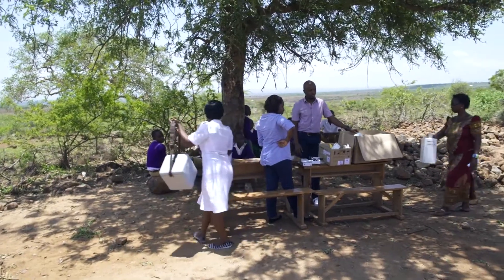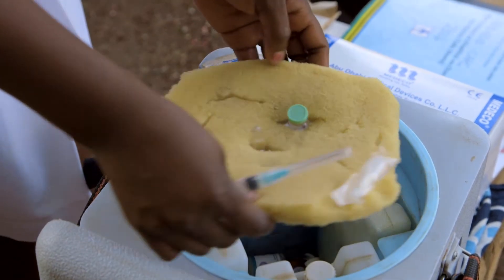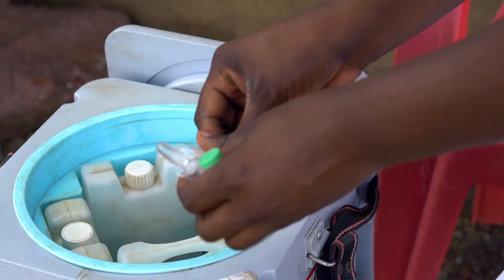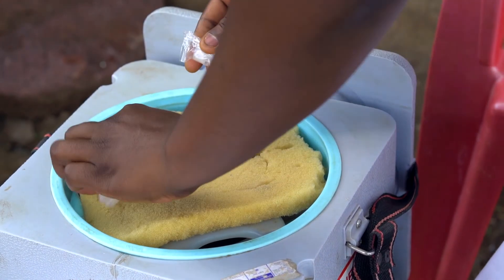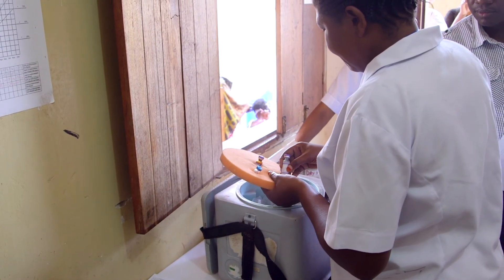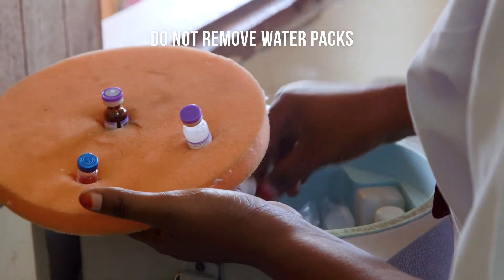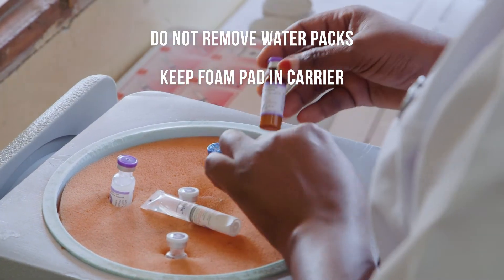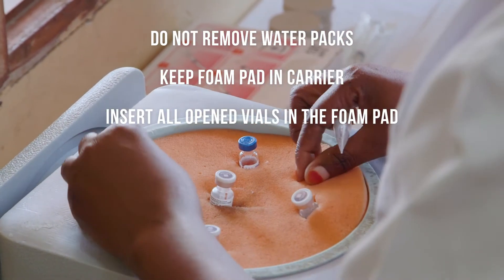At the immunization session, you will rely on the vaccine carrier to keep vaccines and diluents at the right temperatures. That includes opened vials, and especially vials that do not contain preservative, whether lyophilized or liquid. Here are some key things to remember when using a carrier during a session: do not remove the water packs from the vaccine carrier. Keep the foam pad over the top of the carrier to serve as a temporary lid. Insert all opened vials in the slits of the foam pad.